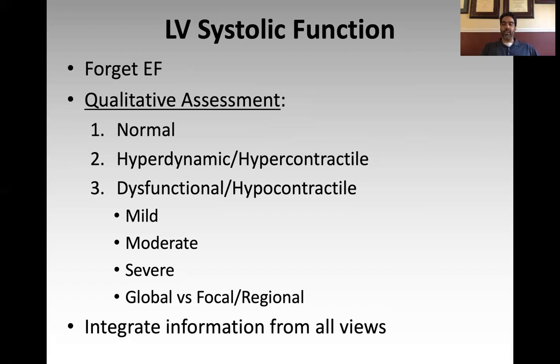And I think there's 2 reasons for that. One is that it takes a very large amount of skill and experience and knowledge to be able to accurately determine by visual parameters the patient's ejection fraction. To put it into perspective, cardiologists have to, in the very least, the last I understand, interpret 300 formal echoes and perform at least 150 formal echoes in order to meet the minimal qualifications to interpret echoes and to do things like make visual assessments of ejection fraction.